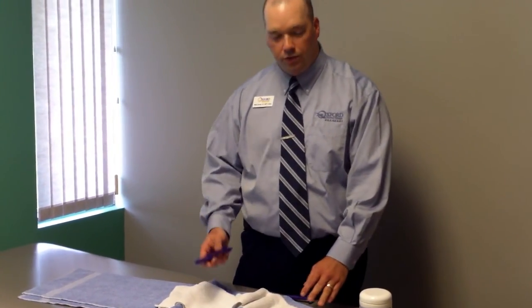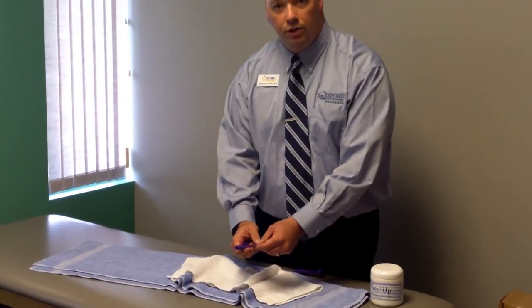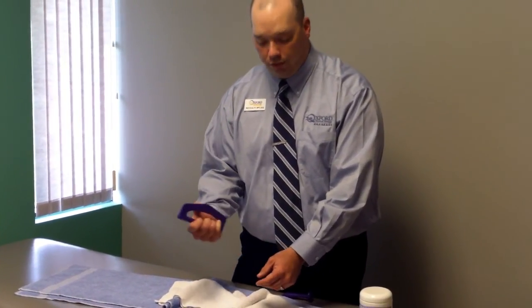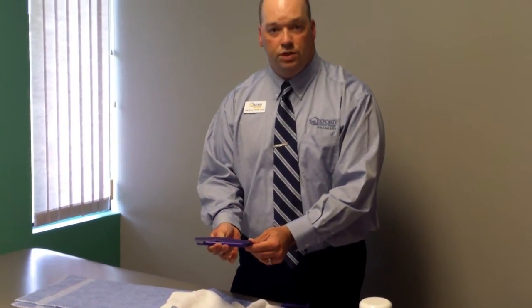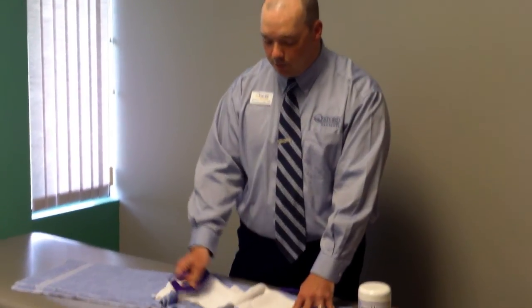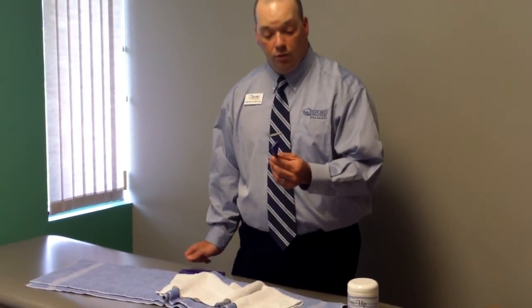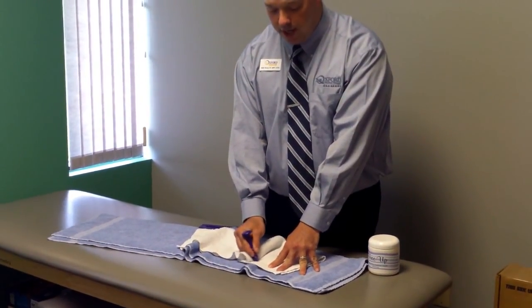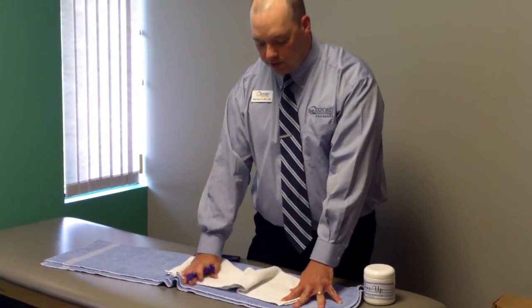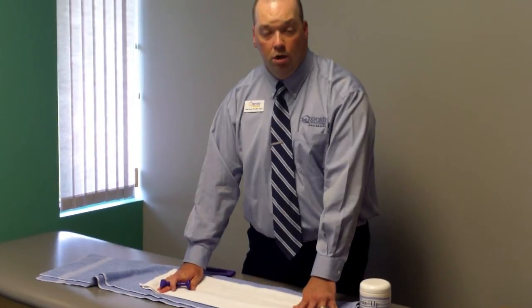So what we do is come in with the tools and we move across the tissue, and they make a bit of a little sound or a pop that the therapist can feel through the tool, and then we're able to find it. This larger tool is what we use as the searching tool. So we might scan the muscle or scan the area, find the pops or cracks, and then we would move in with a smaller tool and treat the area, going back and forth and doing some breaking down. That helps to flatten this tissue out so that we get that nice normal flat scar that we're looking for, or a flat tendon after an area of injury.